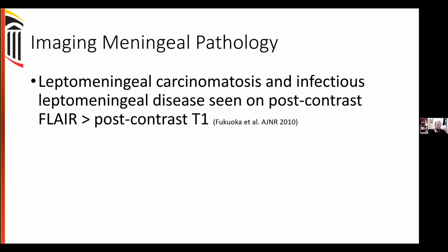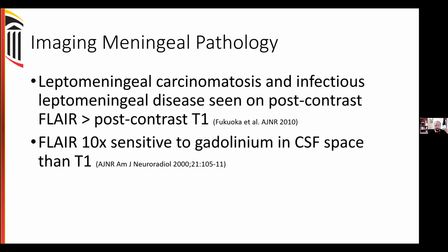And if you look at just the standard post-contrast T1 acquisitions, if you think back to one of those early slides where I showed the standard acquisitions in MS, we don't see meningeal inflammation, meningeal infiltrates on the post-contrast T1, really just see changes in the white matter in active lesions, but don't see meningeal enhancement on post-contrast T1 images.